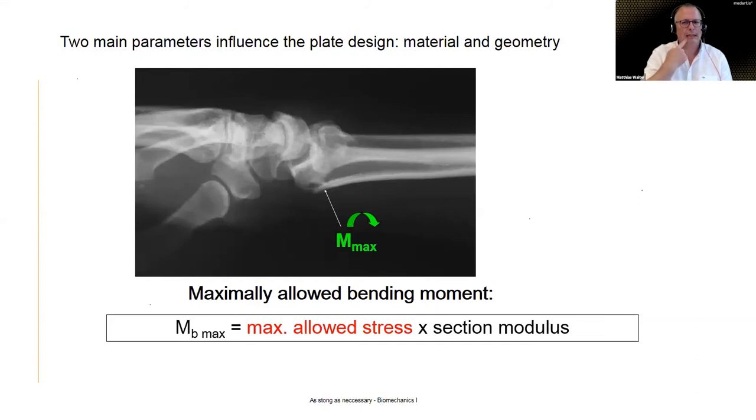But if you take, for instance, a dental implant, it has a very rough surface, because the idea there is what's called osseointegration. You want those bone cells to directly grow onto the surface and to anchor around the implant. Now in osteosynthesis, this is not what we want, because we want the gliding tissue to still be able to travel freely and easily over the titanium surface. Now, if you go back 20, 30 years, manufacturers were not quite aware of this. And sometimes you ended up with a rough surface, maybe something that was sandblasted or glass bead blasted.